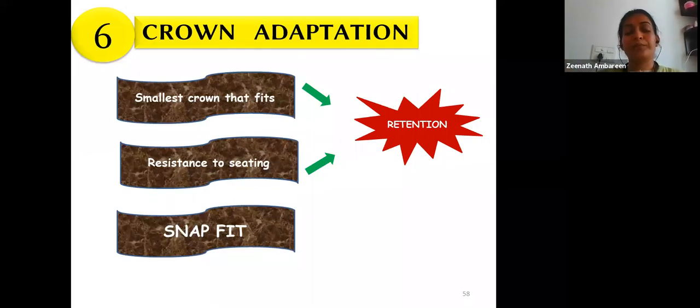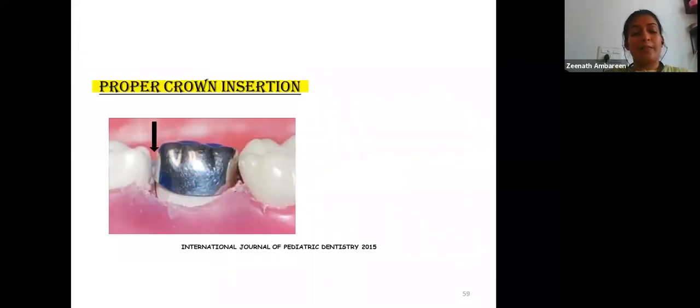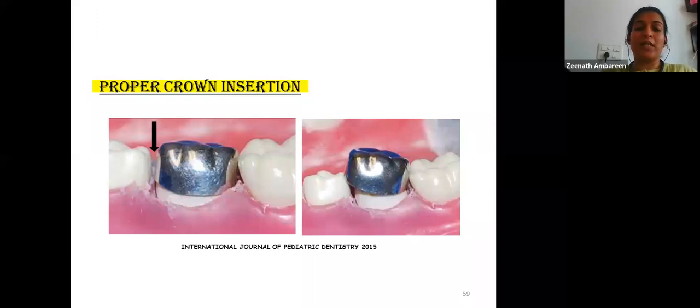Once the crown is fit, some blanching of the marginal gingiva indicates the crown has extended too far. Subgingival extension must be limited to about 1 mm. The mesiodistal inclination of the path of insertion should be parallel to the margins of the adjacent tooth; mesial or distal inclination will result in locking out of the crown. Use a thumb forcep to select and handle the crown to keep contamination to a minimum.